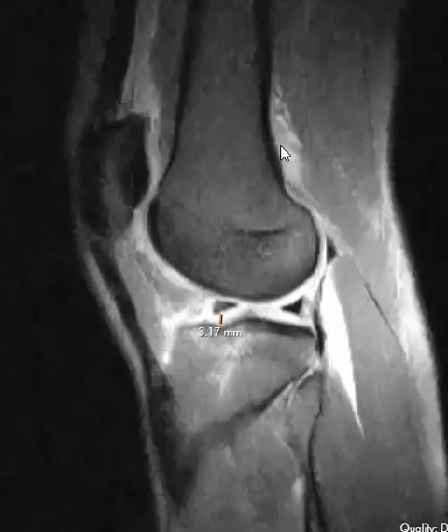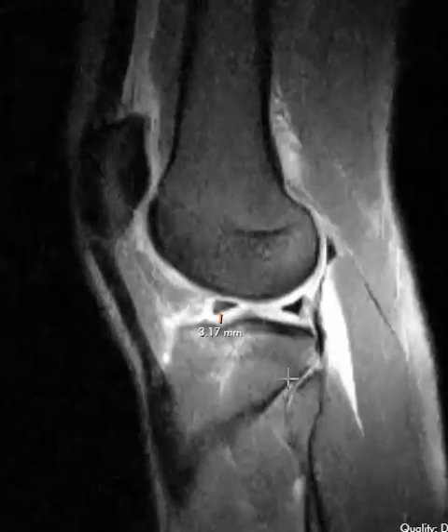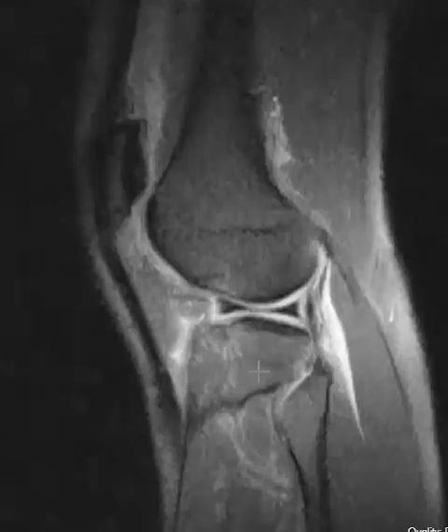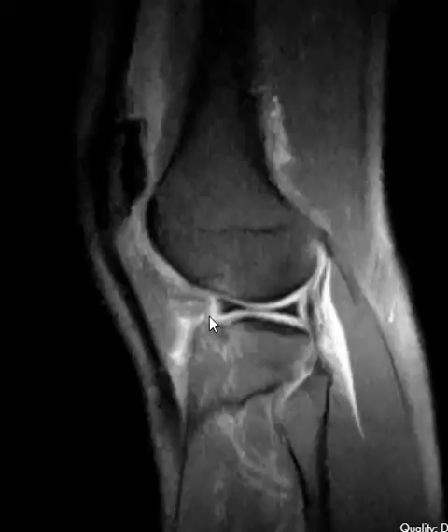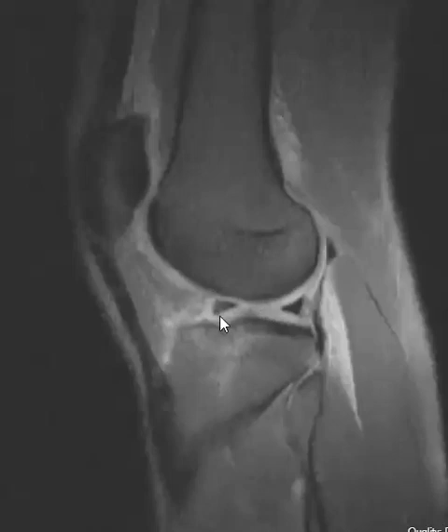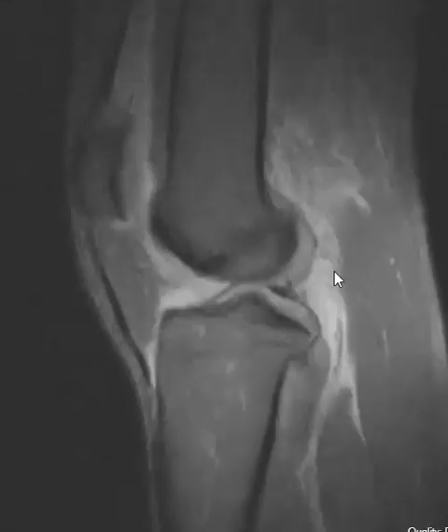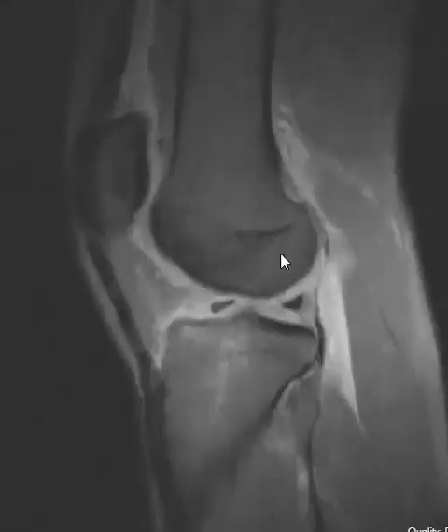It's torn and stripped from the femur right there. He also has bone injuries here in the anterolateral side — some kissing contusions. We have one on the tibial side here with a little cortical depression of about 3 mm, and on the femoral side another little bone contusion. So this is an injury where he extended the knee and it kissed out on the lateral side — a hyperextension, valgus stress injury where it impacted here and then stretched the back of the joint, ruptured the posterior joint capsule, and tore off the lateral gastrocnemius tendon origin.